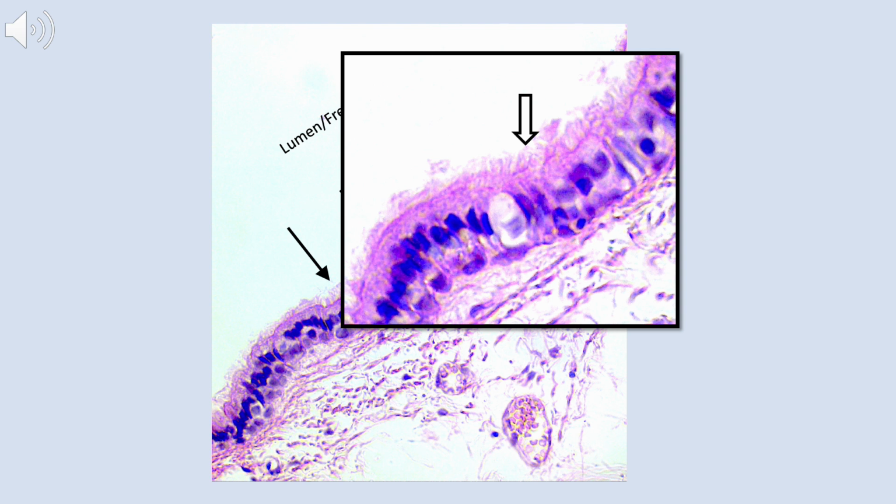I can confirm that by looking at the nuclei. While it might appear as if there are two layers, there actually aren't. Those cells are all touching the basement membrane, and most of them reach the surface, but there's a lot of cells that are kind of crowded out from the surface. However, they're all still touching the basement membrane, so they're all one layer. The other thing is the goblet cell that appears in that layer too. Those are frequently found in the respiratory epithelium or pseudostratified columnar epithelium. They're also found in simple columnar, but this is clearly not simple columnar epithelium.